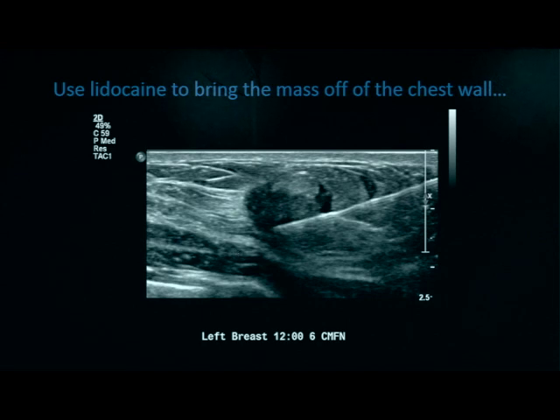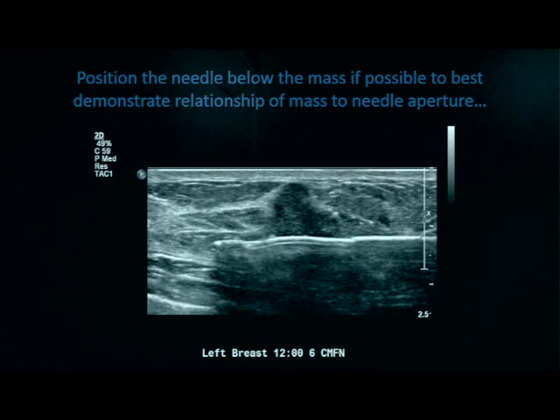Lidocaine can be used for local anesthesia, deep anesthesia, and to raise a deep lesion up. Here we see the entire needle in view — we're injecting anesthesia to lift that lesion off the chest wall, making it more superficial and thus less dangerous to biopsy. Position the needle below the mass if possible to best demonstrate the relationship of the mass to the needle aperture. Here we see a nice picture of the needle tip, the aperture opening, and that ridge at the end of the aperture right below the mass. Documentation of each pass gives us a great idea of what tissue we obtained, how it correlates with pathology, and helps with surgical planning.